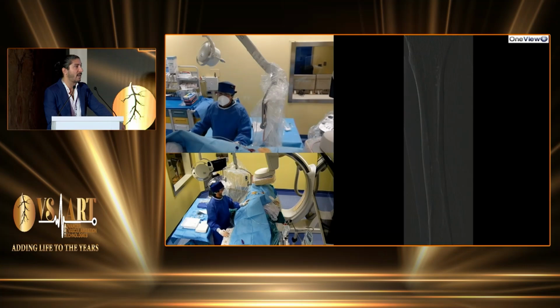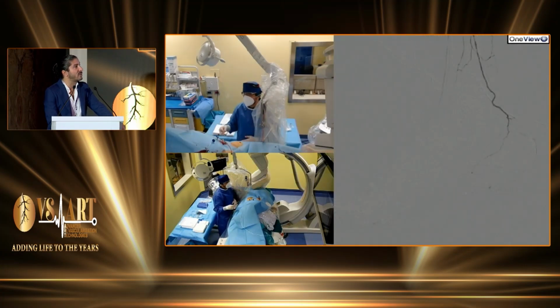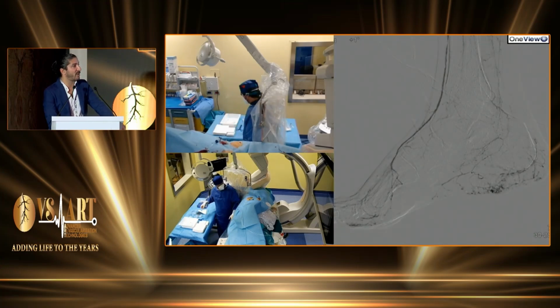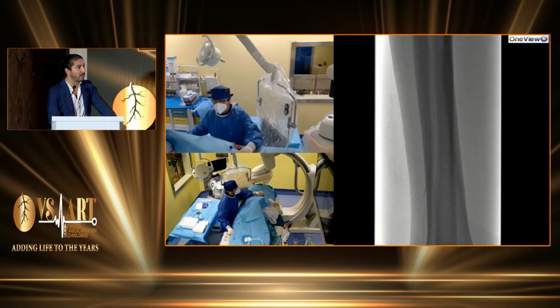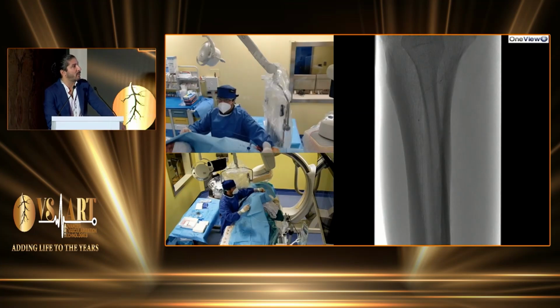This is the case again. This is below the knee, so above the knee was healthy, no vessels below the knee, distal peroneal feeding plantar arteries and distal anterior tibial feeding dorsalis pedis patent. So completely or relatively easy case. We engage the anterior tibial, the 4 French catheter never passed, but the guide wire navigated to the dorsalis pedis. So we shift the 4 French catheter for a balloon. The balloon never passed, and when we inflated, the balloon was broken.